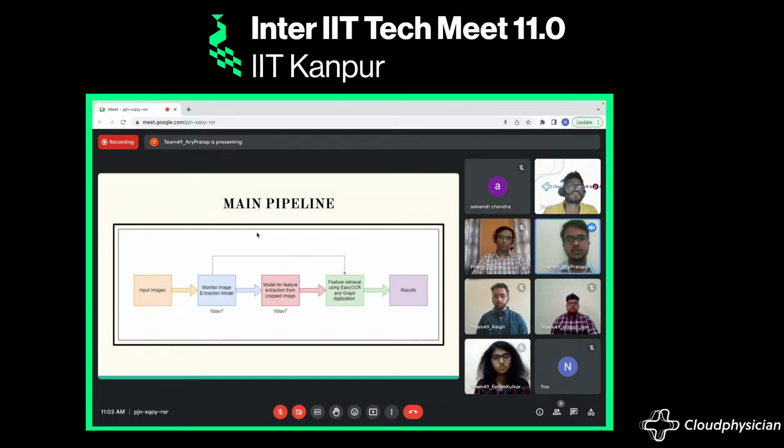And then this data frame is sent to the third stage of our pipeline, which is the feature retrieval part. Basically, this feature retrieval part takes two inputs. First is the data frame, which consists of the bounding box coordinates of each of the predicted features in the monitor screen, and second is the monitor screen itself, which was the prediction of the monitor image extraction model.